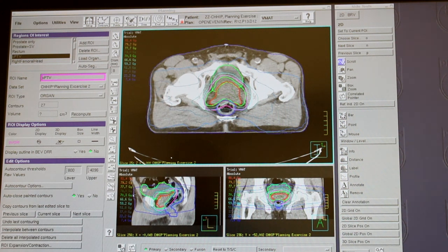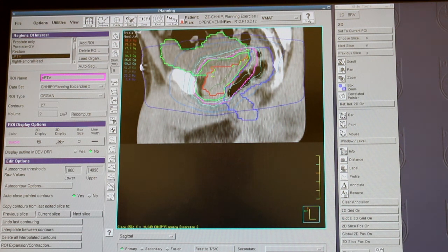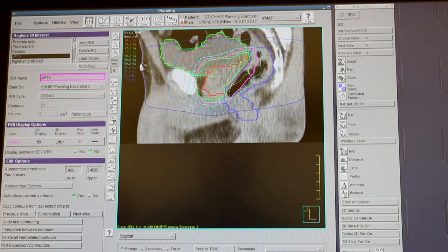Looking at the sagittal view — here I've blown up that sagittal cut — we can see the red structure is our target that we want to treat, the pink shape around it is the planning target volume we want to cover, the blue shape at the back is the rectum, and the green shape is the bladder. By using 90 individual fields rotating around the patient we can really shrink-wrap where the dose is going, wrap very nicely around the pink shape, and really pull in and spare dose to the rectum and reduce the dose to the bladder.